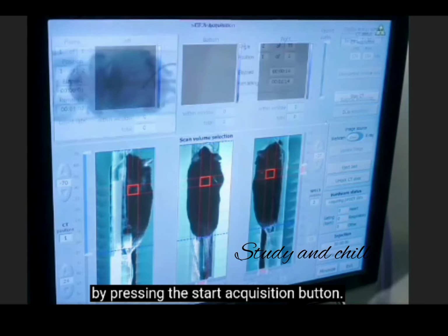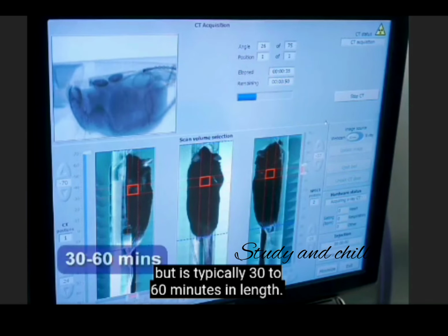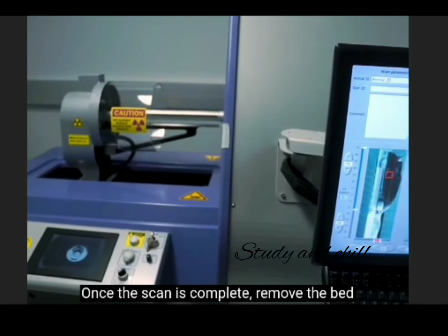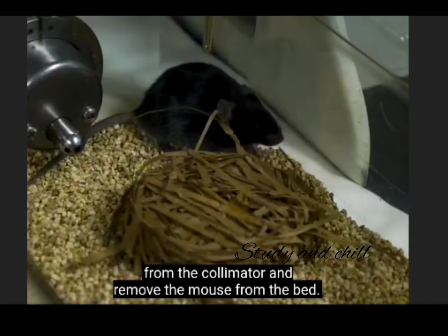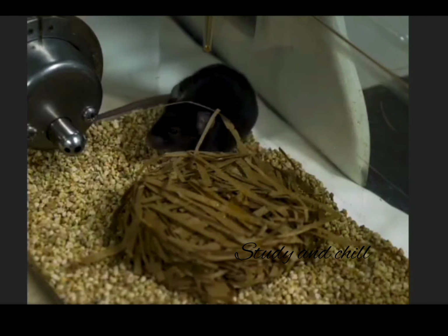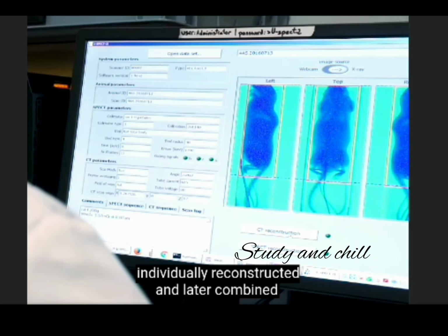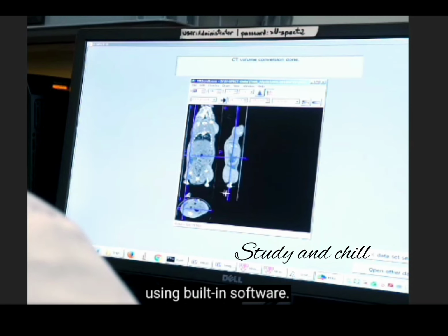Once the scan is complete, remove the bed from the collimator and remove the mouse from the bed. Monitor the mouse until it is conscious and can move around normally. The SPECT and CT images gathered can now be individually reconstructed and later combined using built-in software. Let us now review the results of the SPECT CT imaging.